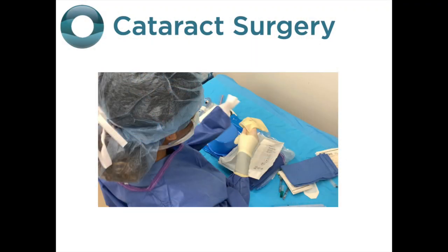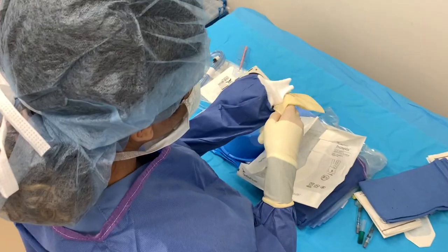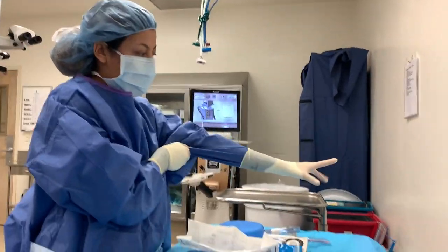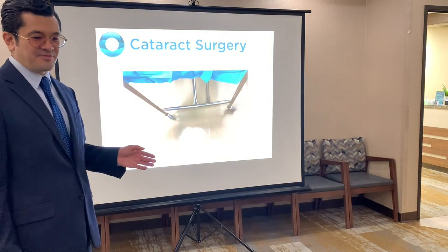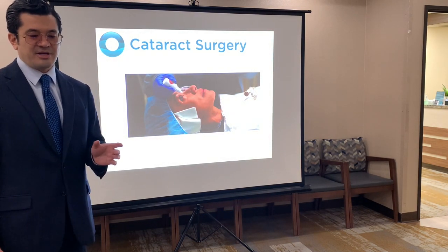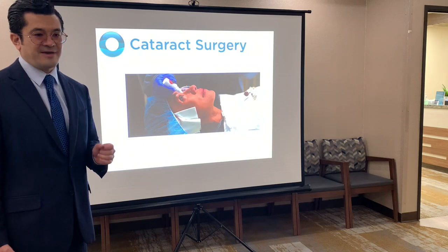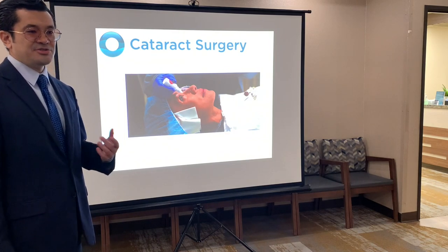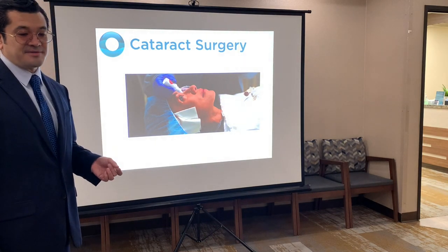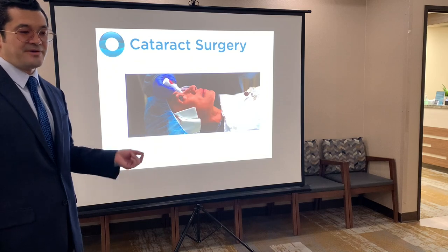When patients are brought into the surgery room, Laura's already there getting things set up. I think, good, it does play. So there she is, putting her gloves on. She then gets all the tools ready for surgery, so I hope you guys saw that. The patient's on the table, we roll the patient right up to the microscope, and then the nurse is going to put a couple of anesthetic eye drops in the eye. Usually we'll use a proparacaine or a tetracaine, some type of anesthetic. And interestingly enough, that's just enough to make it through the whole surgery, just a couple of eye drops, topically.